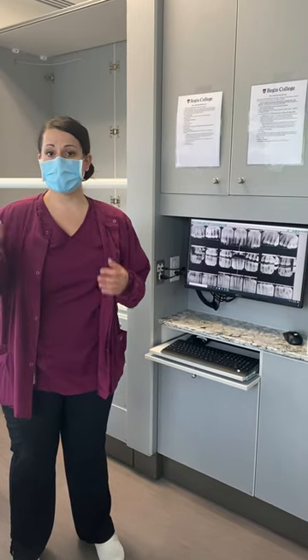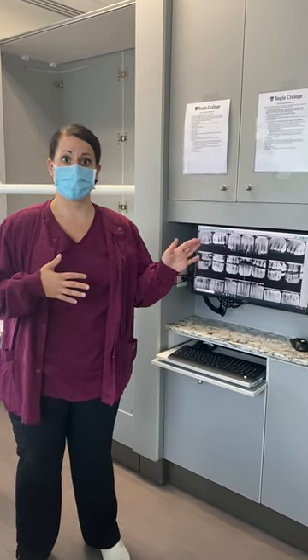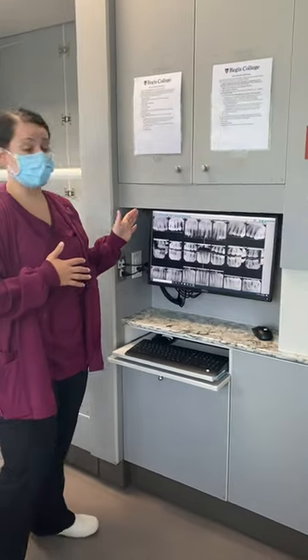So now what we're going to show you is how to place bite wings on Dexter, but also set it up on the computer. We're going to show you horizontal bite wings.